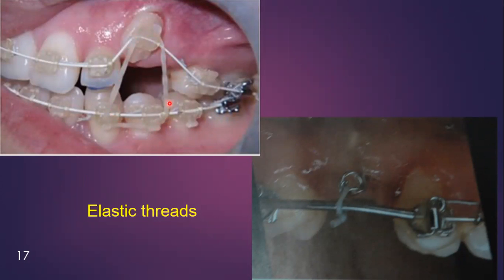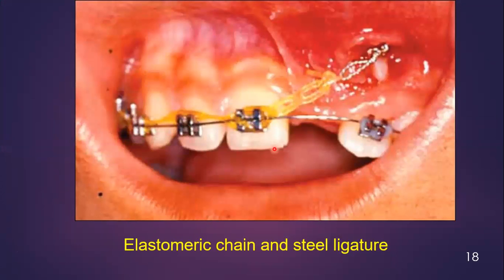Easily you can identify it. Most commonly used when you need very small forces, but the disadvantage is that it becomes loose after some time.